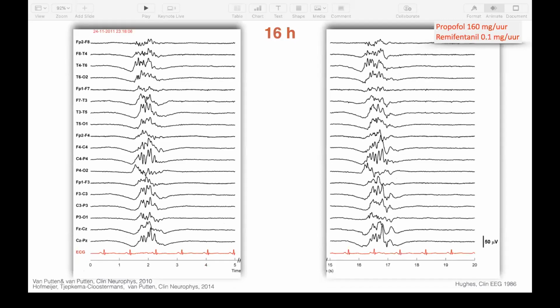This is an example of burst suppression with identical bursts. So this is epoch 1, epoch 2. There can sometimes even be a time in between of minutes. But if you observe the bursts in the same channel on subsequent time intervals, it can be noticed that the shapes are very similar within the channel. And this is known as burst suppression with identical bursts.